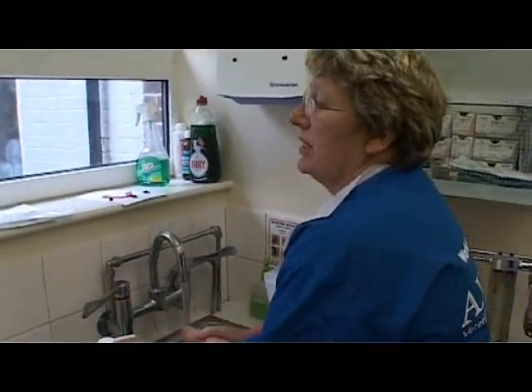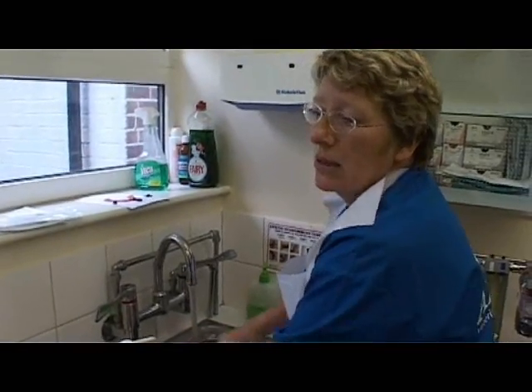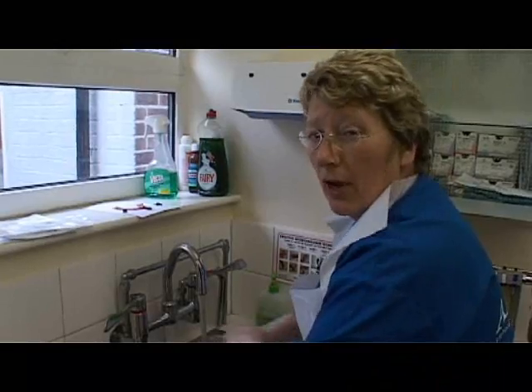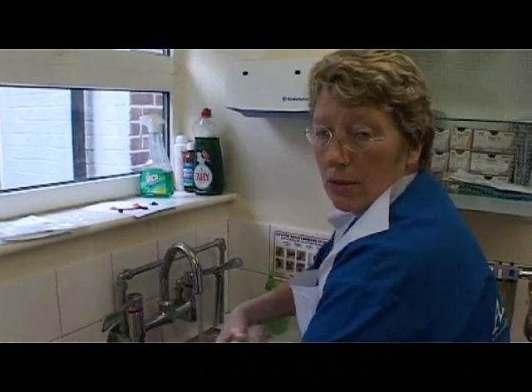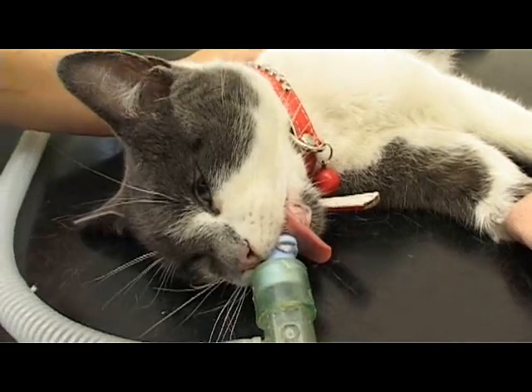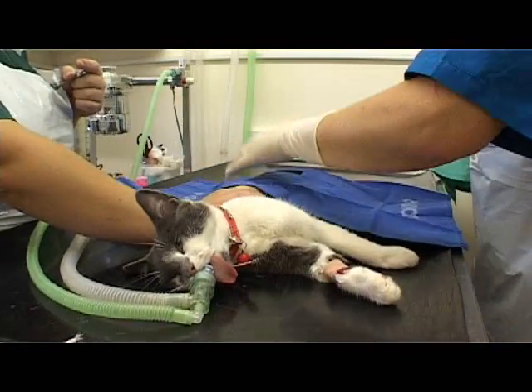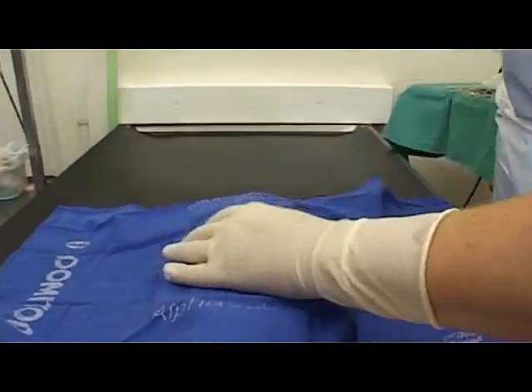We tend not to need masks because the bugs that we carry aren't the same bugs as affect cats and dogs as much as affect people. And because, particularly here at a branch surgery, the infected load of the theatre isn't anywhere near as high as it would be in a human theatre that's being used 12 hours a day, and we're probably using this maximum of 3 or 4 hours of the day. That's its heart I'm feeling there. You can feel a pulse under its tongue. That's a little bit more difficult with cats because their tongue's so small. Don't think you'll be able to see anything there.